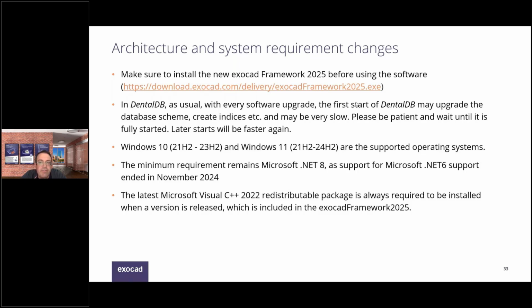Windows 10 and Windows 11 are still compatible. Those are supported operating systems. Windows 10 for a little while longer; I think support is ending soon for Windows 10 from Microsoft. Microsoft .NET 8 and .6 are supported. Oh, .6 ended in November 2024, so .8 is the current version that's supported in this release. And then Visual C++ 2022 is required on this system.